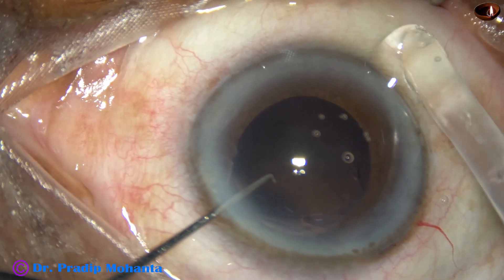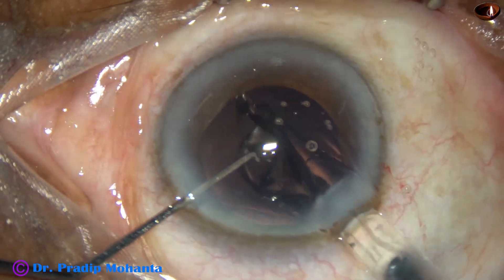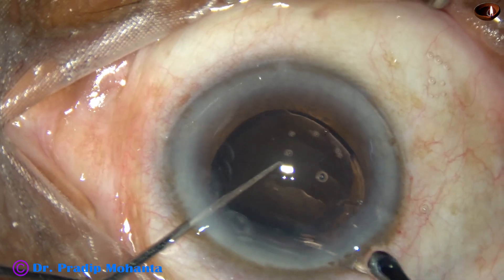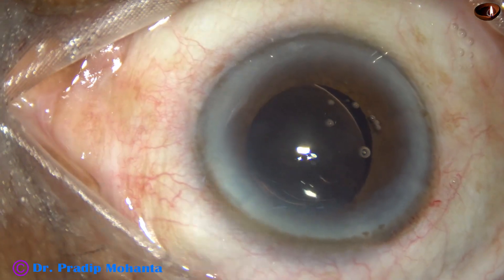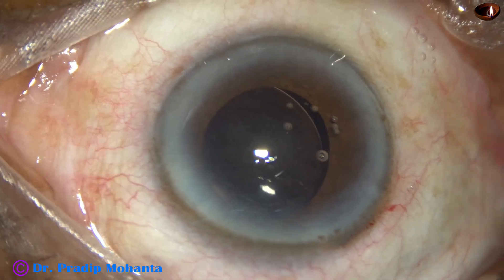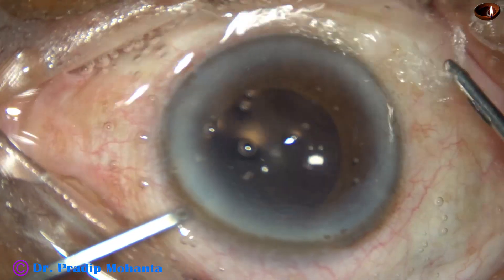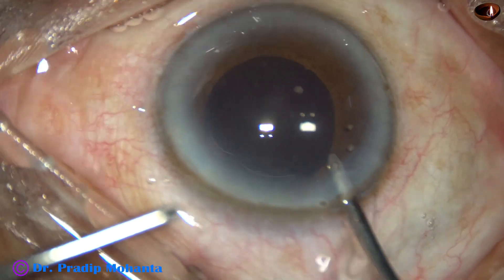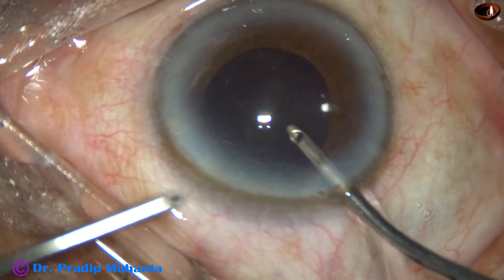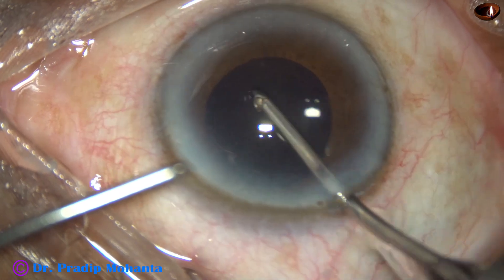The nucleus is managed and there is hardly any cortex. The anterior chamber is filled with viscoelastic and a monofocal single-piece intraocular lens is placed in the capsular bag. The viscoelastic is then nicely cleaned by manual irrigation and aspiration.